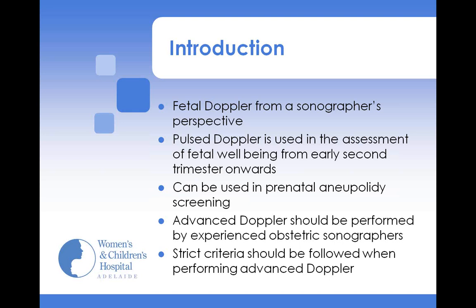So as we all know, fetal pulse Doppler is used in the assessment of fetal well-being from the early second trimester onwards, and can also be used in prenatal aneuploidy screening. And advanced Doppler especially should be performed really by experienced obstetric sonographers if possible, and we follow strict criteria when performing advanced fetal Doppler.